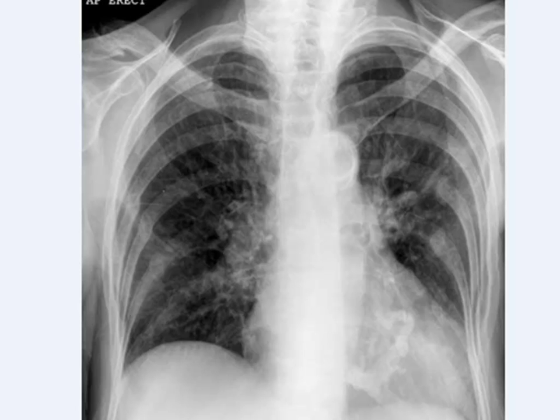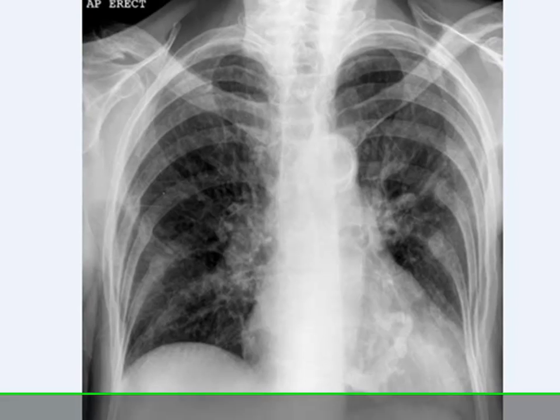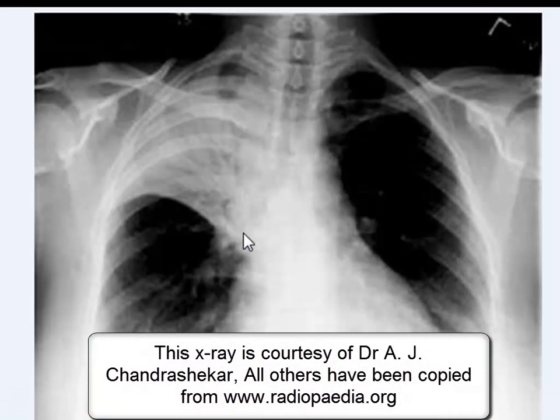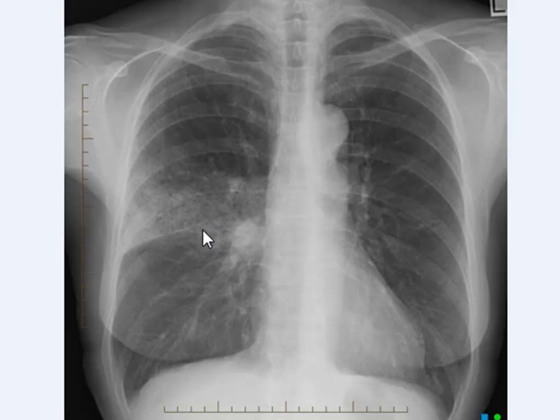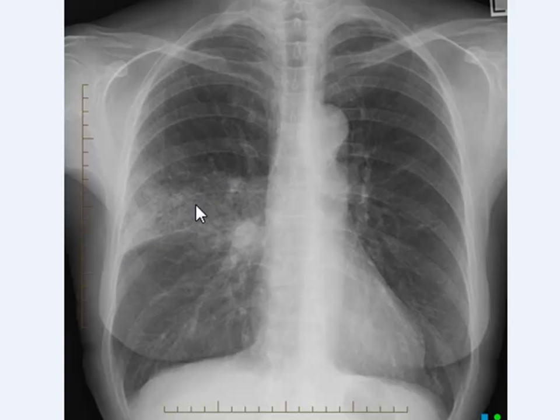It is only visible if it is parallel to the X-ray beam, and for that reason it is not visible in a number of normal chest X-rays. However, certain conditions delineate this fissure very clearly. This X-ray, for example, has right upper lobe consolidation, and because the consolidation is confined to the right upper lobe, you can clearly see the horizontal fissure starting from here and finishing here. In this next example, the patient also has upper lobe consolidation — the whole lobe is not consolidated — but you can still see the horizontal fissure clearly.